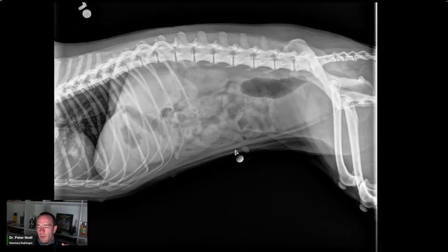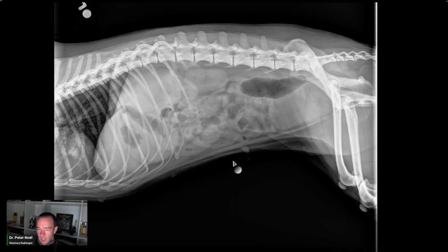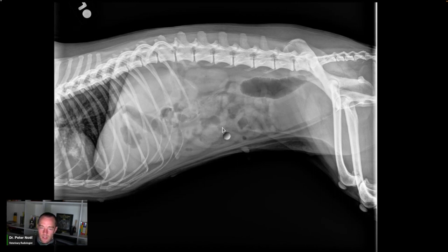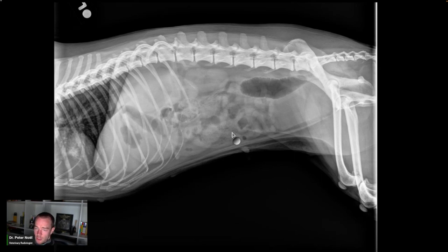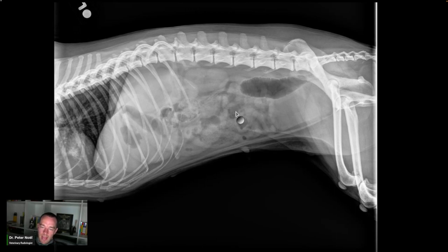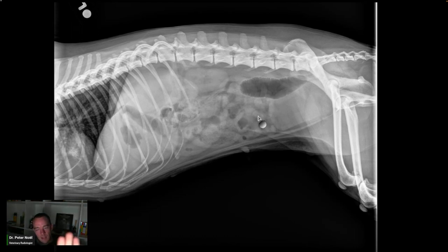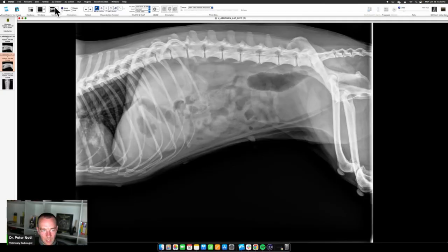This is an obstruction. If you're not convinced the dog is obstructed, one thing you could do is a pneumocolonogram — put gas into the colon and the gas will cruise right by the obstruction, confirming it's in the small intestine. Another technique: take a wooden spatula, press it straight into the belly while taking the rad simultaneously. The spatula move displaces bowel contents and makes things surprisingly more clear.